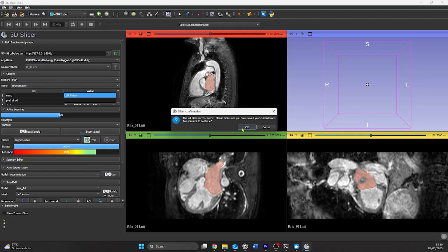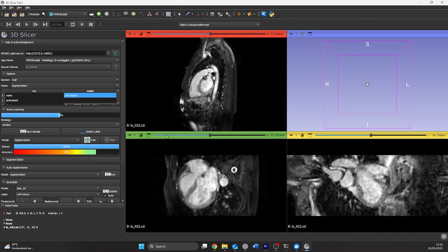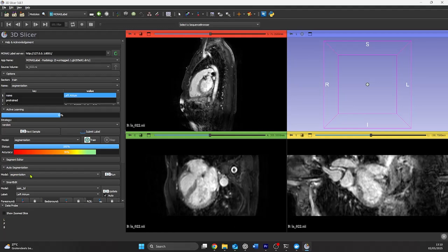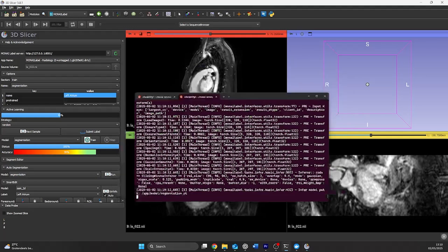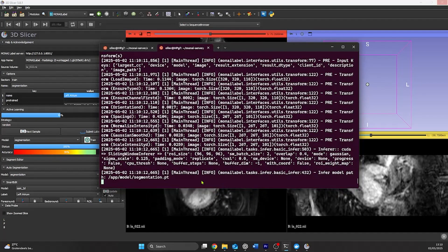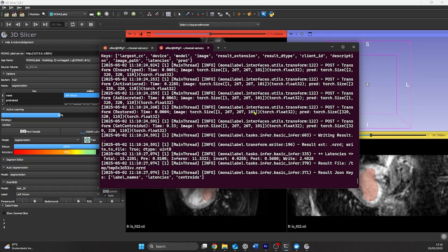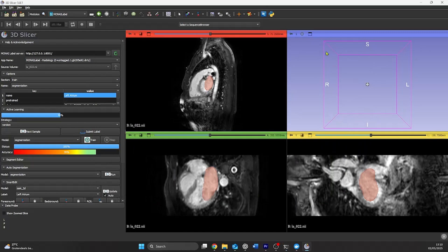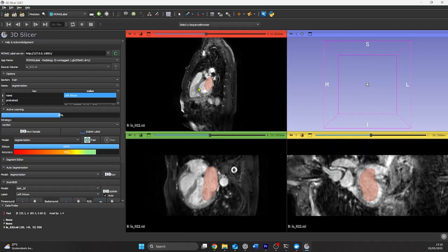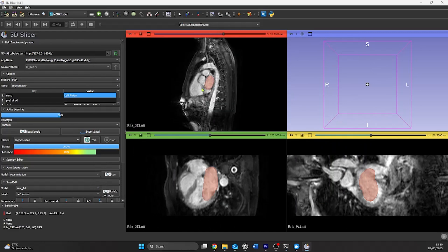Next, we can load a new sample to see how our model works. In the auto segmentation tab, we use the segmentation model because that is the model that we've been training and we run it. We can then see in WSL that it's using the model. Then we can see how it fits over the CT we made and we can see it in 3D.